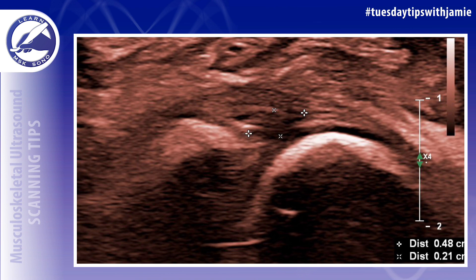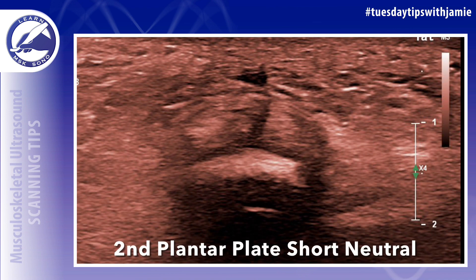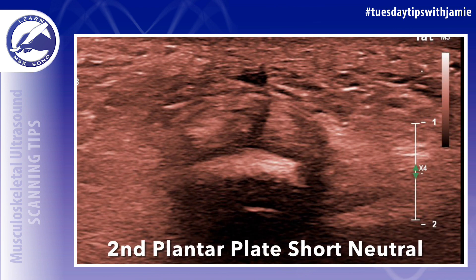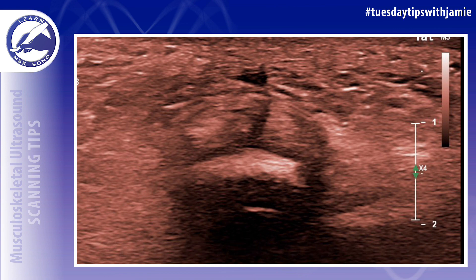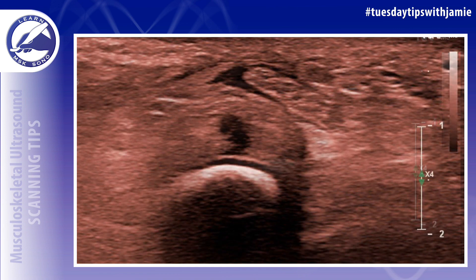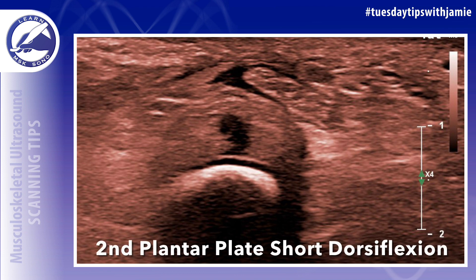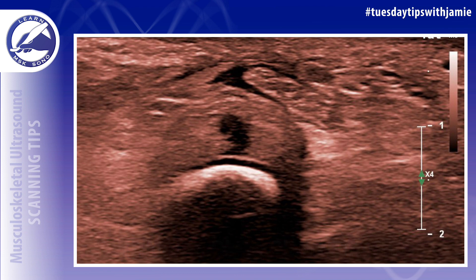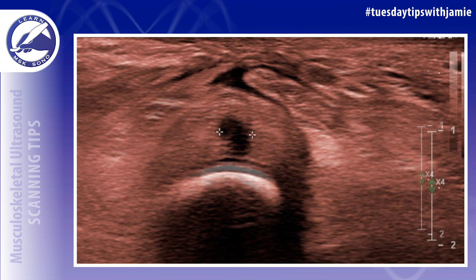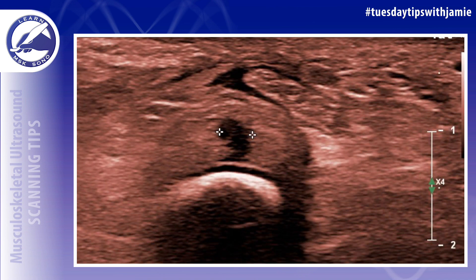A finding of fibrosis may be visualized in the web space adjacent to a plantar plate tear and must be differentiated from Morton's neuroma. The main difference in appearance is that fibrosis will be seen hugging the metatarsal head along the MTP joint capsule, whereas a neuroma will be seen in the center of the web space and will be continuous with the plantar digital nerve.